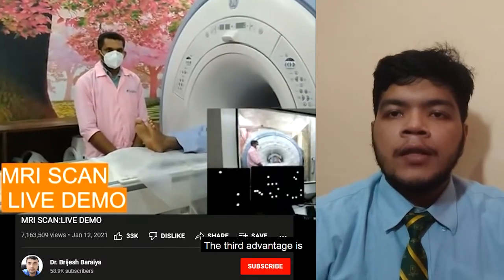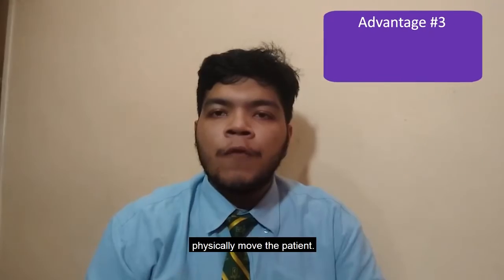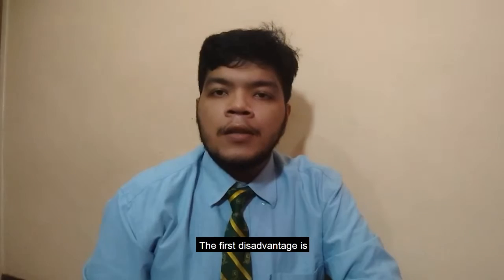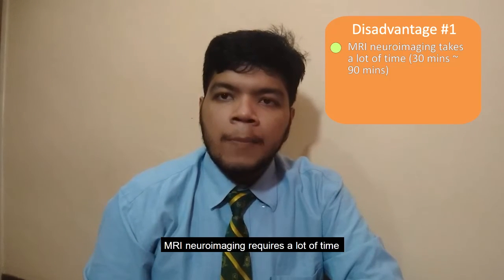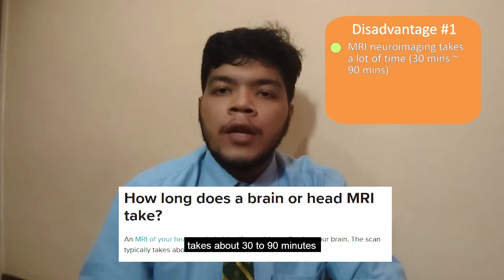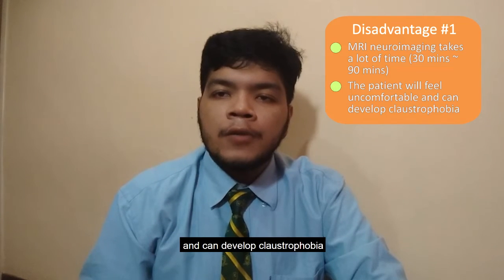The third advantage is MRI imaging can be held without having to physically move the patient. Thus, it eases the process of taking multiple images. The first disadvantage is MRI imaging requires a lot of time when taking multiple images. A typical MRI imaging takes about 30 to 90 minutes, which makes the patient feel uncomfortable and can develop claustrophobia.